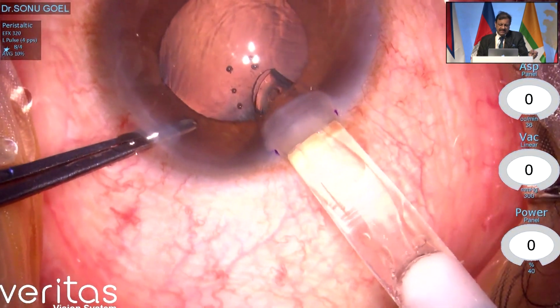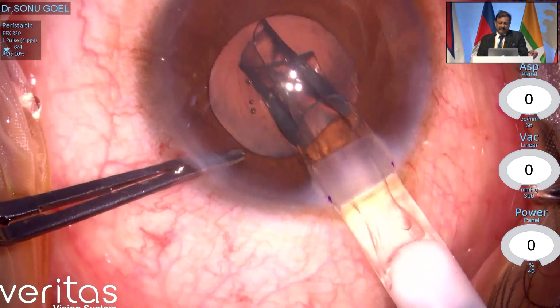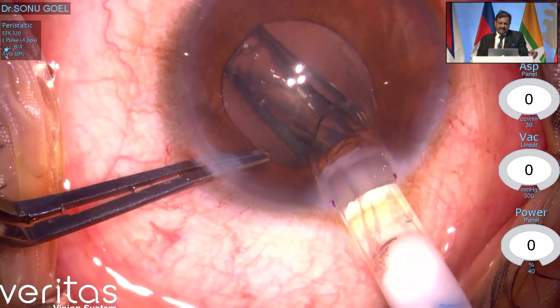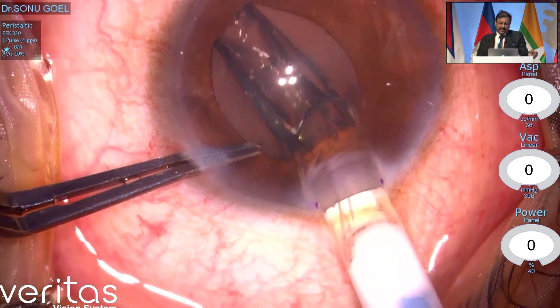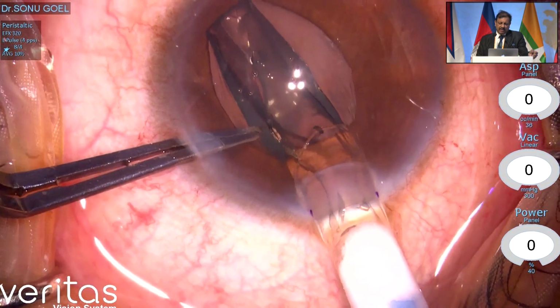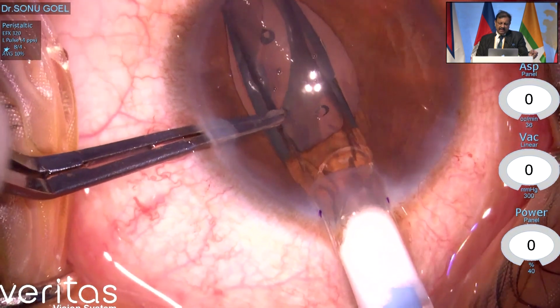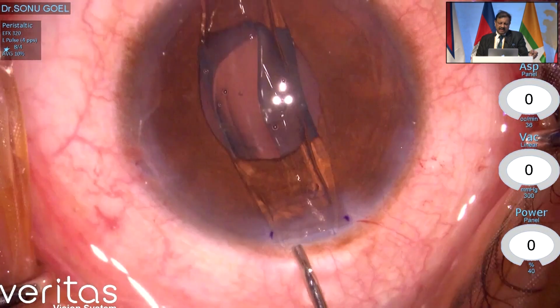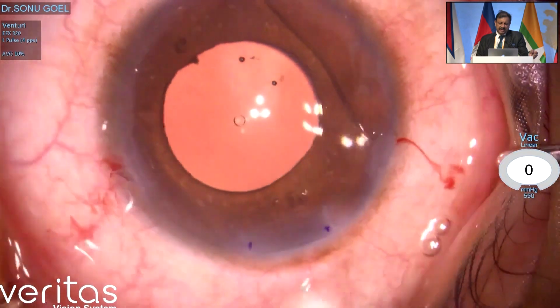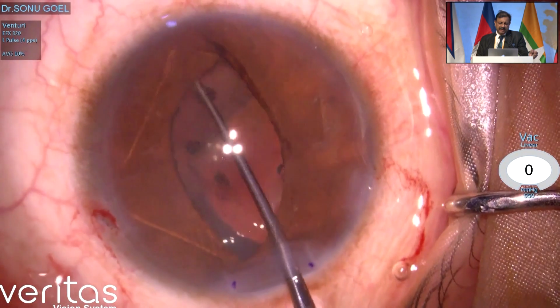Now this is a quite interesting patient, non-dilating, around 4.5-5 millimeter pupil, and we thought of using a pupil expanding device, but unfortunately we were lucky enough to have the lens inside the eye. So you don't try to push the lens directly underneath the iris. Let the lens unfold in the anterior chamber, push in viscoelastic, let the chamber deepen, and then you can slowly manipulate the lens inside the eye.